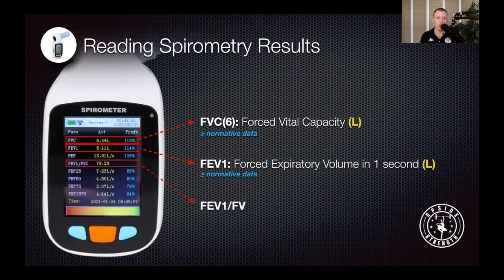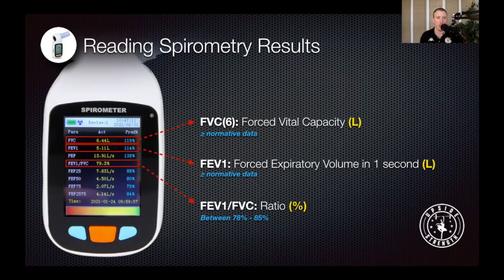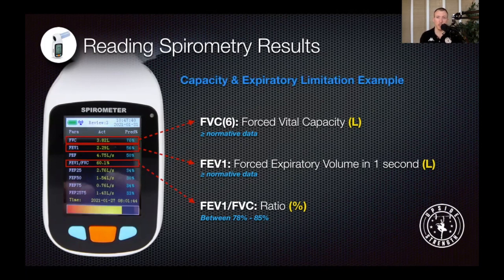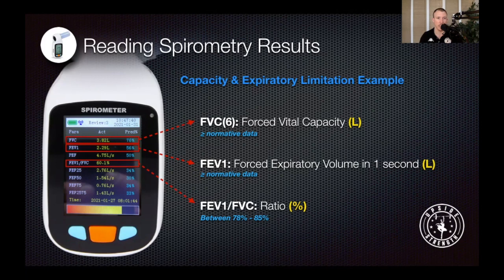The third data point is the ratio between those two values: FEV1 over FVC, expressed as a percentage. We want to see this between 78% and 85%. If the value is below 78%, it indicates that the amount of air the person can breathe out in one second is too low compared to the total space available in their lungs — indicating an expiratory limitation. Here you can see values well below the predicted values for that person's profile, and a ratio at 60.1%, much lower than the 78% threshold. So we can assume a potential capacity limitation — the total volume available is not big enough — and their ability to breathe out is even more restricted, as seen by the 56% predicted FEV1 value and the very low FEV1/FVC ratio.